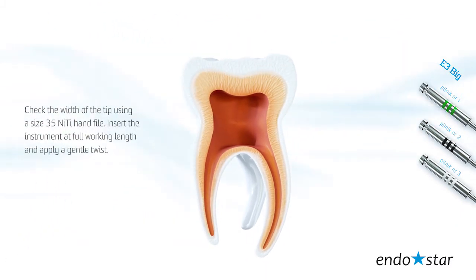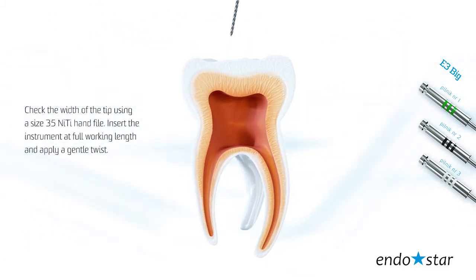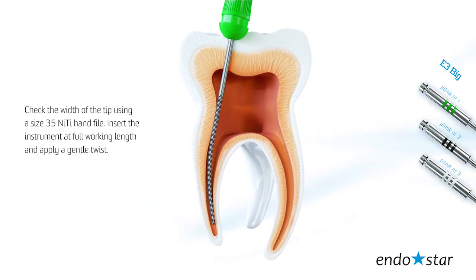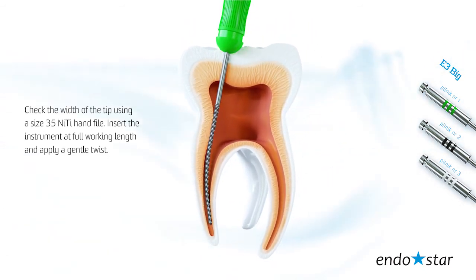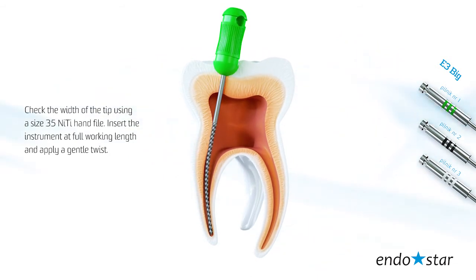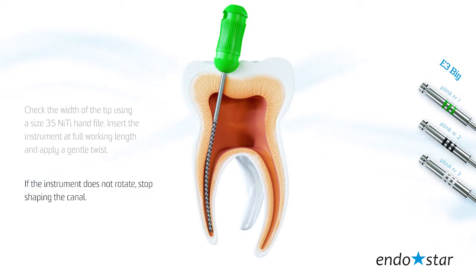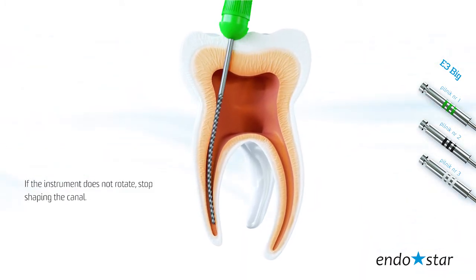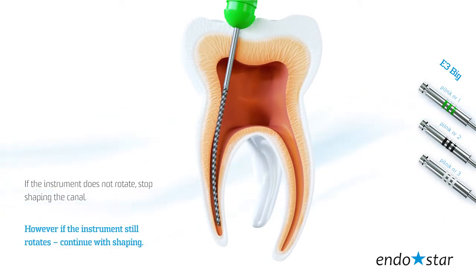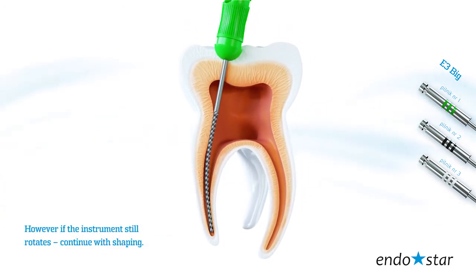Check the width of the tip using a size 35 nickel-titanium hand file. Insert the instrument at full working length and apply a gentle twist. If the instrument does not rotate, stop shaping the canal. However, if the instrument still rotates, continue with shaping.